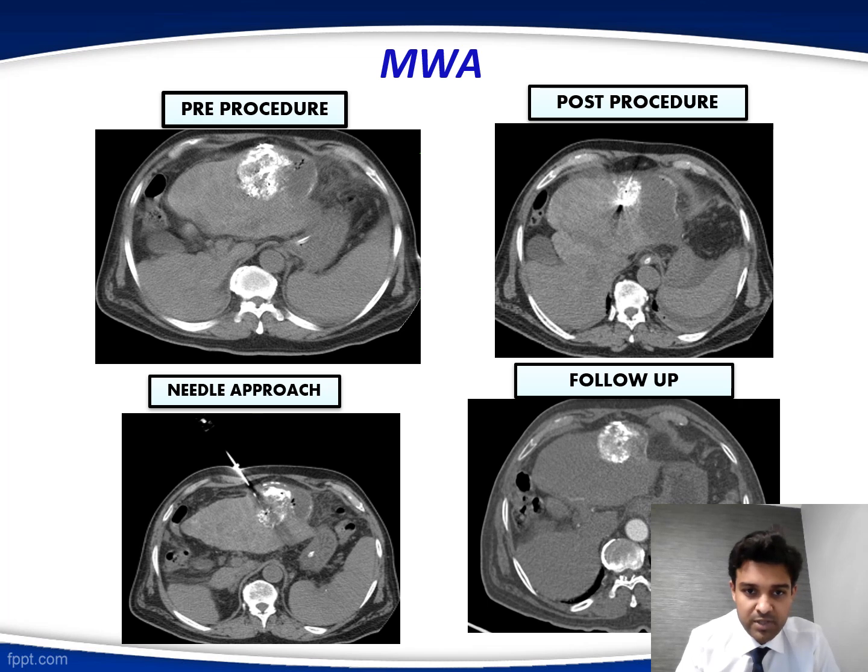So as you can see, the pre-procedure, then the needle approach, the post-procedure after the ablation, and the follow-up. No complications were seen. The patient was advised to do triphasic CT scan after 4 weeks.